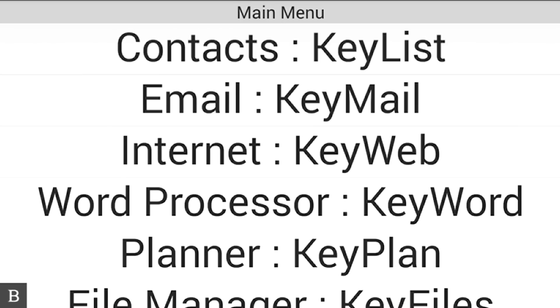Because the BrailleNote Touch is a Google certified device, we have access to the Google Play Store. Google Docs comes pre-installed on the BrailleNote Touch. What we're going to do is edit a shopping list.